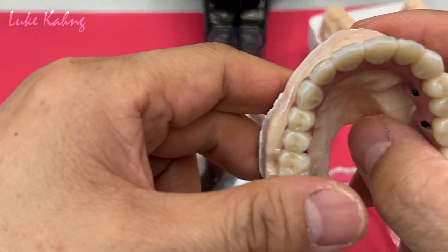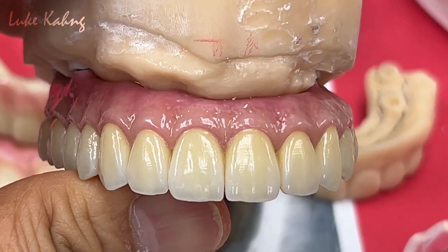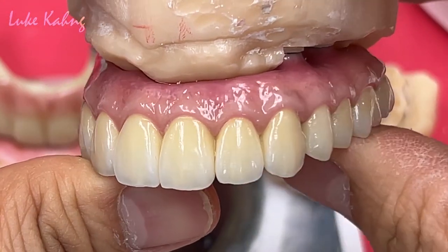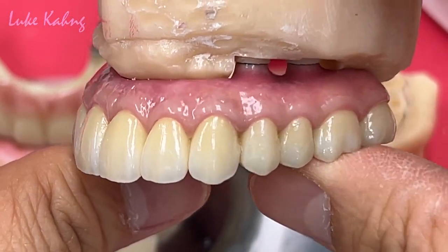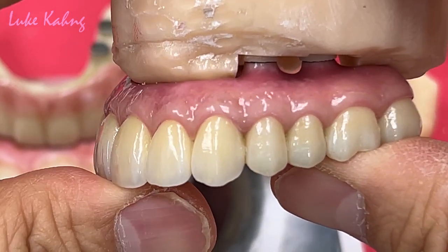After cementation, regarding cementation technique you can see my previous video — there's a lot of cement technique which I already published with the video, and you can watch how I do with the fast setting compared to slow setting.